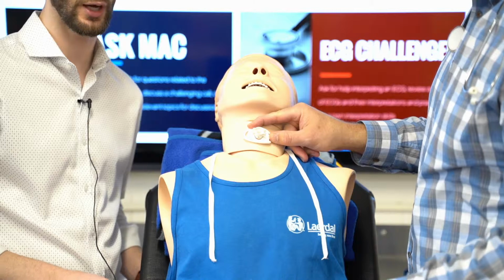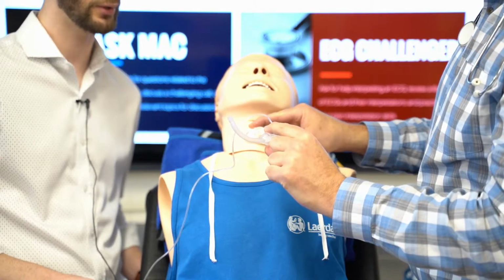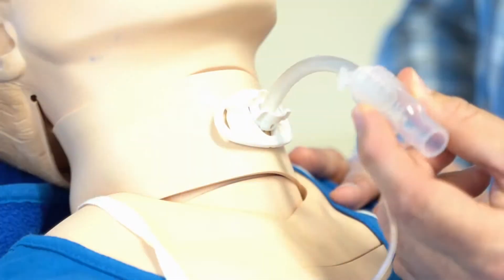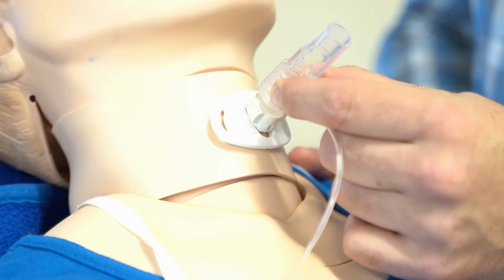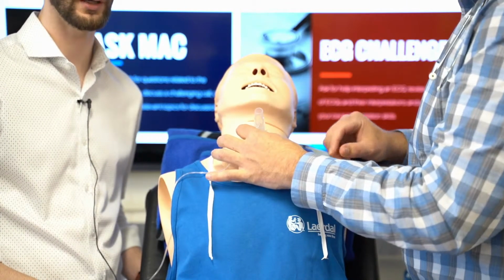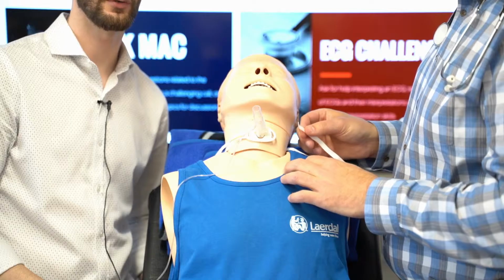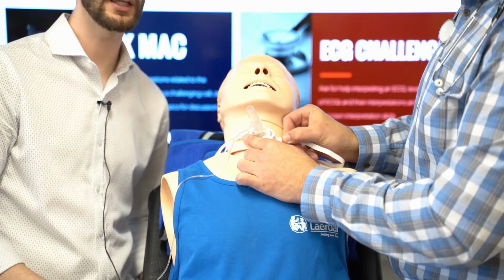And this tube is a Shiley, so we're going to need an inner cannula in place as well. You can go ahead and reinsert that, Pete. Now we've put our end-tidal in place for confirmation, and if we had a cuff, we would go ahead and inflate that as well. Following the successful reinsertion of our tracheostomy tube, we're going to need to secure the airway.